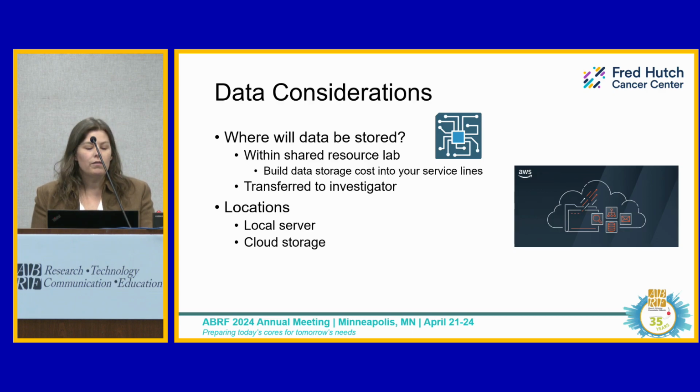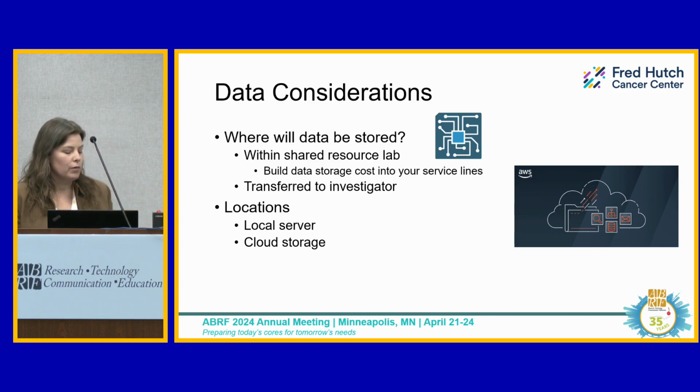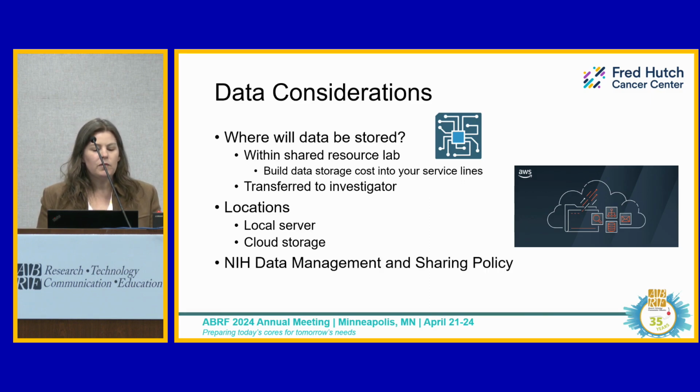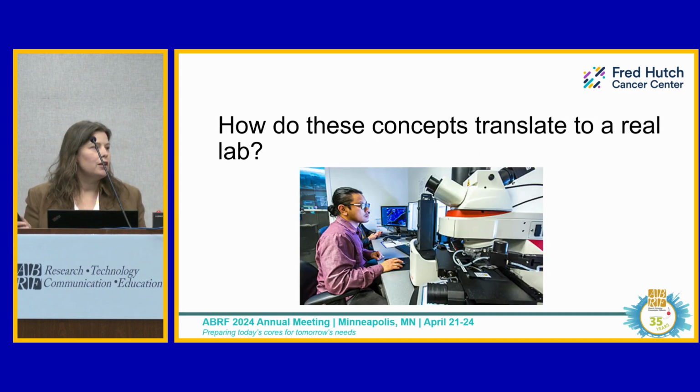And one thing, if it's something that you're just developing de novo, I would go ahead and talk with other cores at your institution and see what they're doing, and see if there's a way that you can marry your service into existing pathways that already exist. And lastly, I just want to mention that there is the NIH data management and sharing policy, and so be sure that you have reviewed that, and that whatever it is that you decide to do is still within compliance of that.